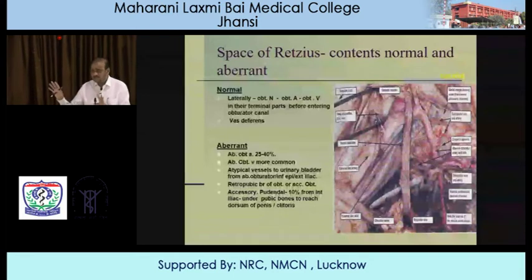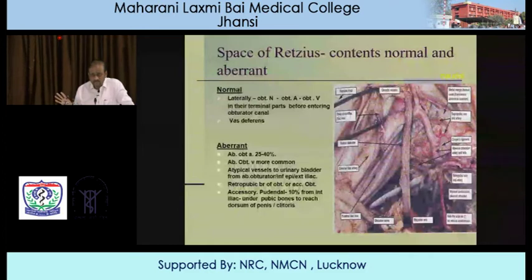But that is a very, very important feature of any kind of laparoscopic repair. The moment you see a vessel running across, stop. Be careful. Because if you have bleeding in this particular area, you have trouble on your hands. I'll just tell you what the trouble is.